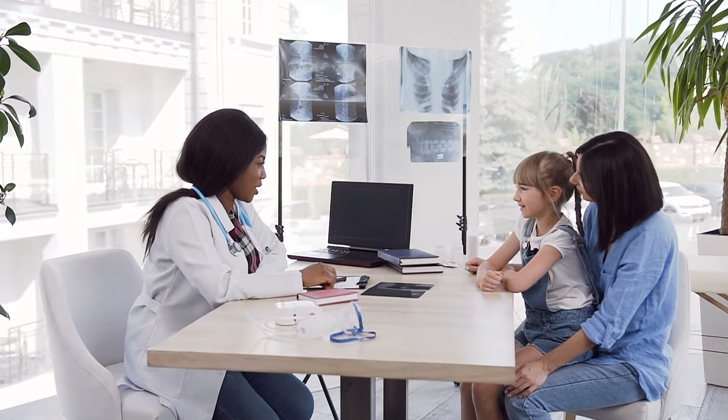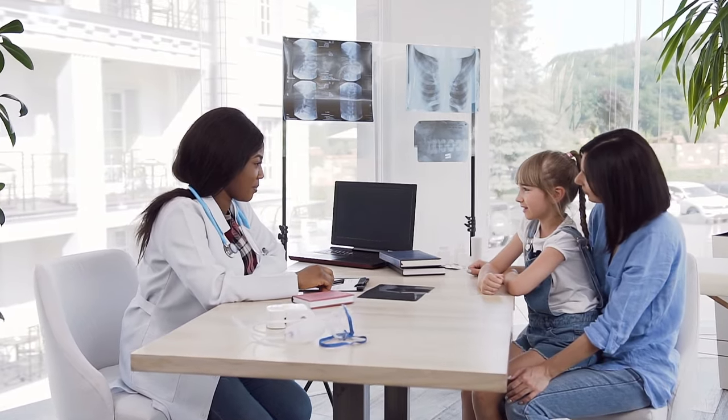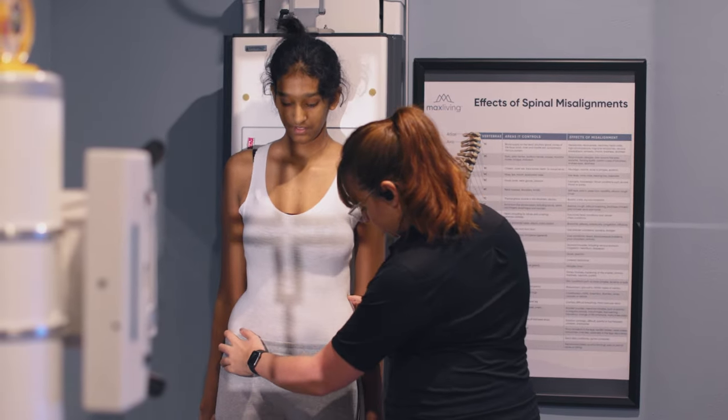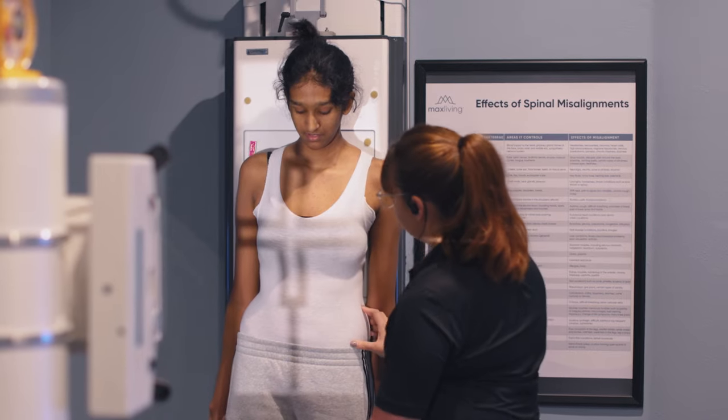The reason why x-rays are the standard in diagnosing scoliosis is because they're the easiest to use — they're accurate, reliable, non-invasive, and very accessible, meaning most patients have an imaging center located near them. X-rays are very quick, very easy, very cheap, and we can actually see what's happening very accurately with scoliosis.